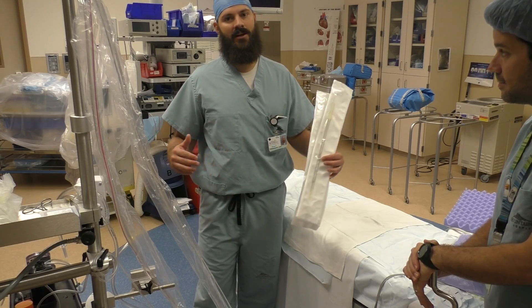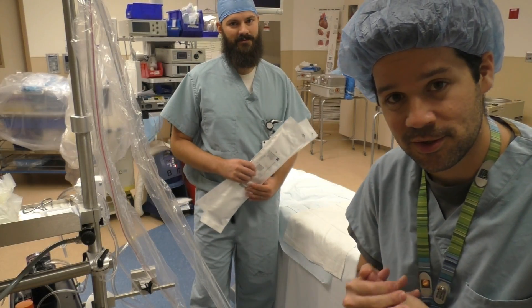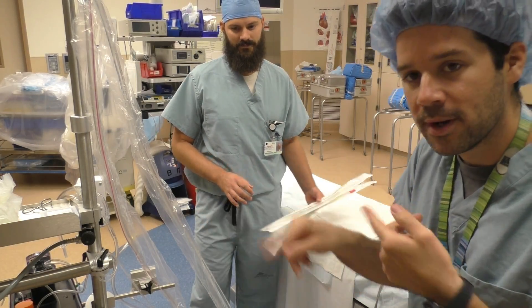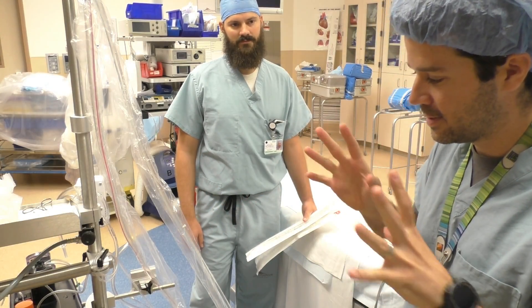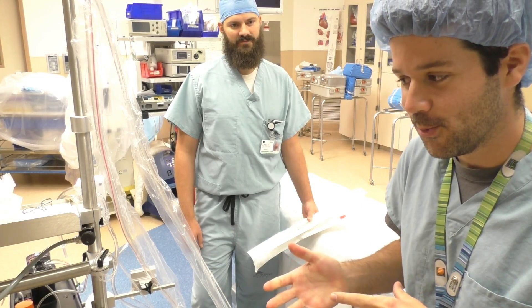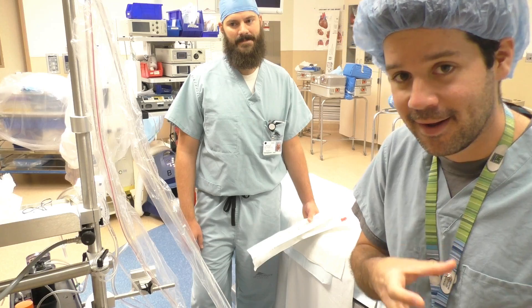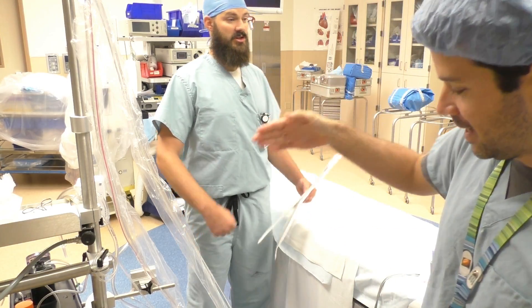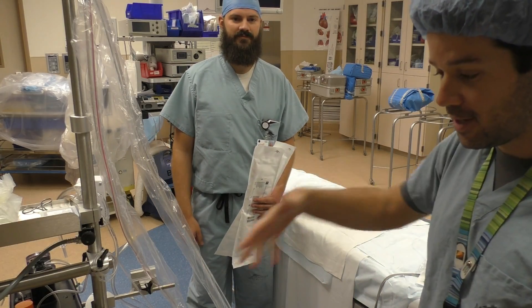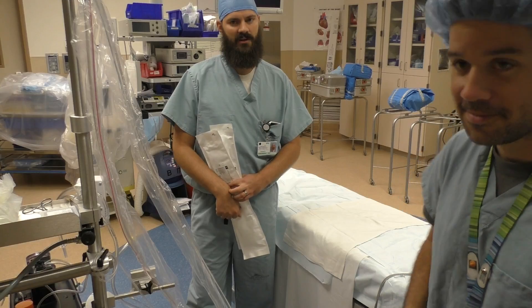It's fast, fast, and then slow — that's just the world we live in. So while you're cannulating, the surgeon is putting in purse string stitches on the aorta and the atrium and all these different places on the heart to place these cannulas. While the surgeon is doing that, at the same time the perfusionist is standing right here wanting you to throw tubing off to him and organize the tubing so he can start hooking up the pump to the sterile field.